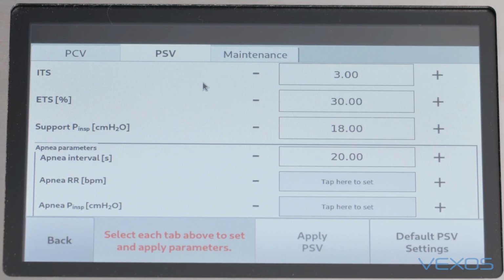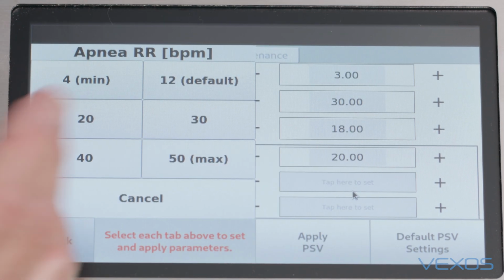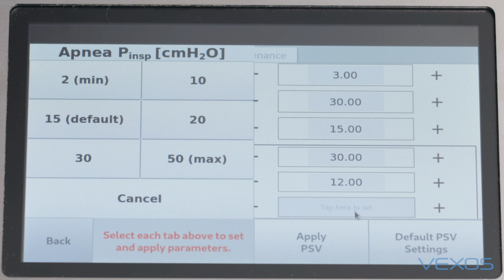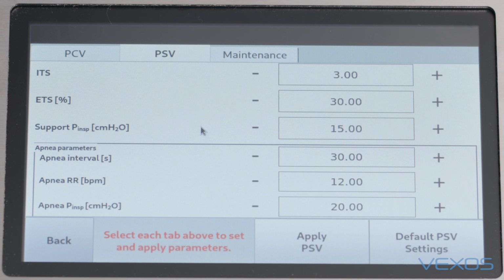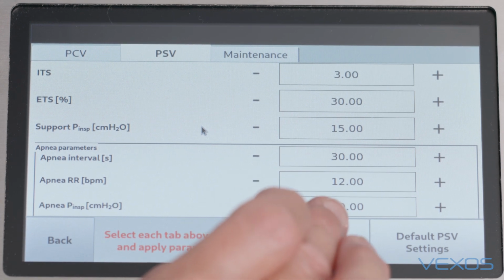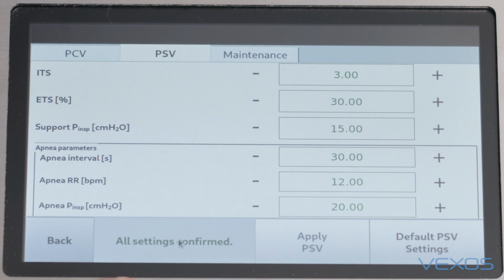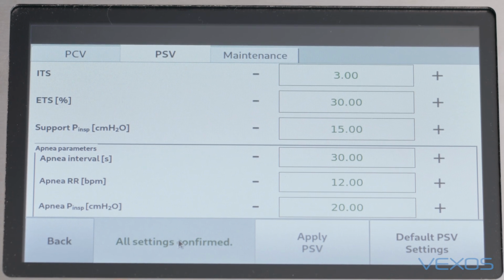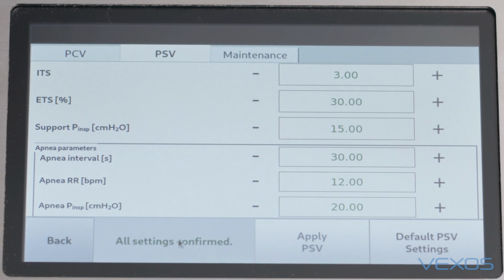The next setting is the apnea respiratory rate. Tap, choose. And the last one is the pressure that's going to be used should the patient stop breathing. Tap, select a pressure, and that is done. At this point, I've checked all the parameters. I'm going to now apply PSV. I'm going to confirm, and it says at the bottom, this is a nice message in green, that says all settings confirmed. I've done all the settings for pressure control and all the settings for pressure support.